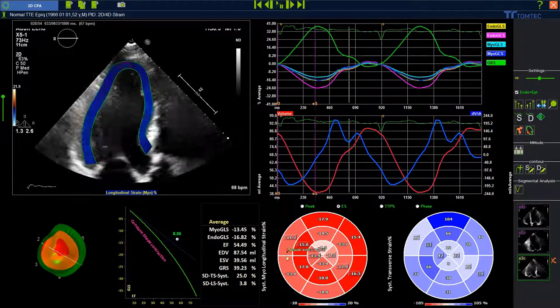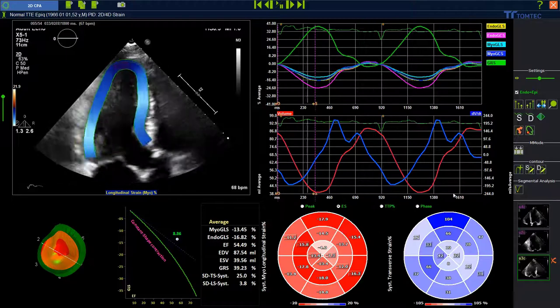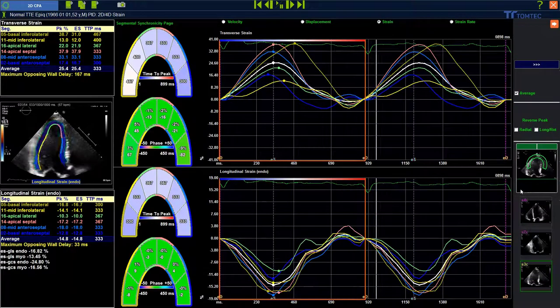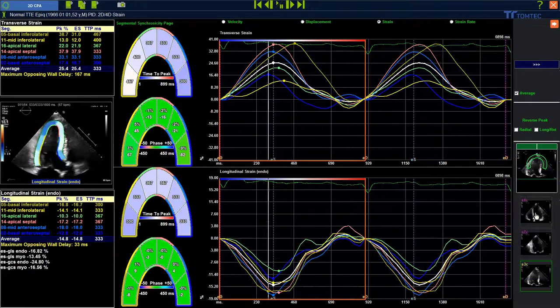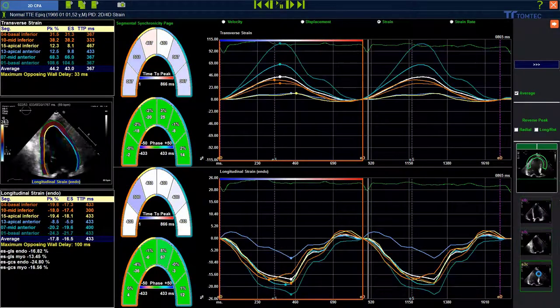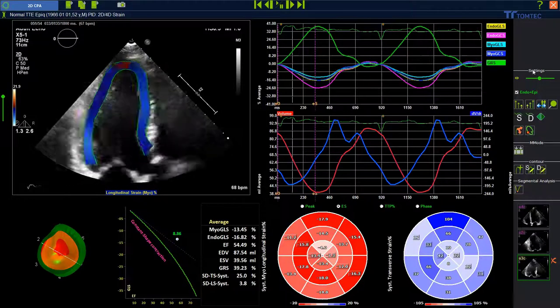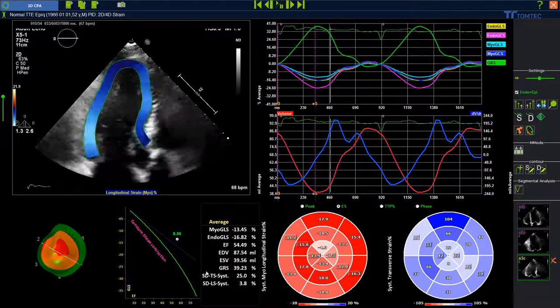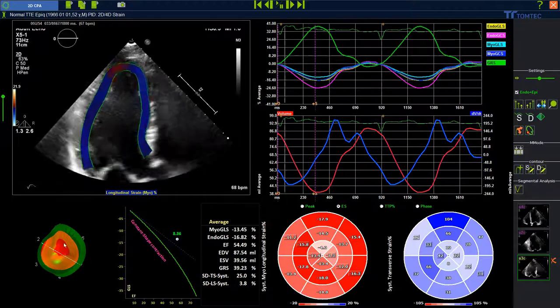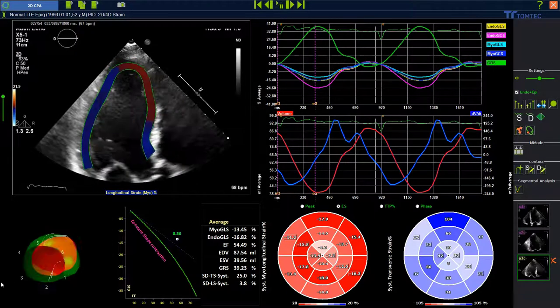The bullseye is now filled with 16 segments. Jump over to the segmental analysis page to see the segmental information available for the different planes. Going back, we can see the average values and on the left a reconstruction for the left ventricle.